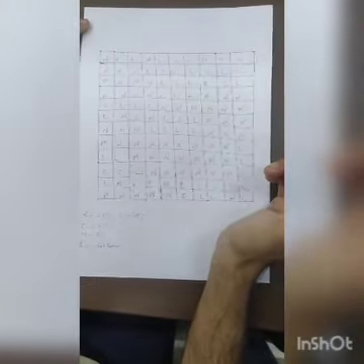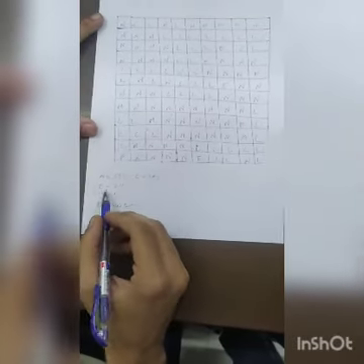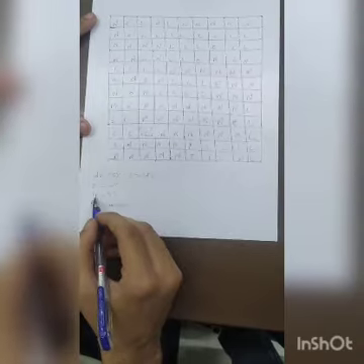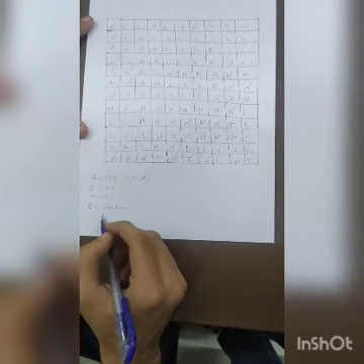Our table is completed. N for neutrophil 55%, eosinophil 2%, monocyte 5%, lymphocyte 38%, and basophil not seen.